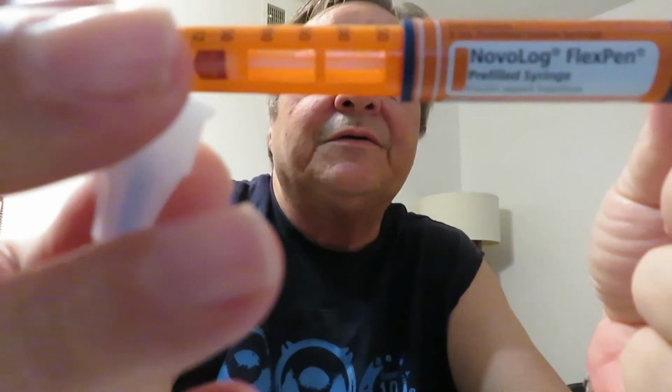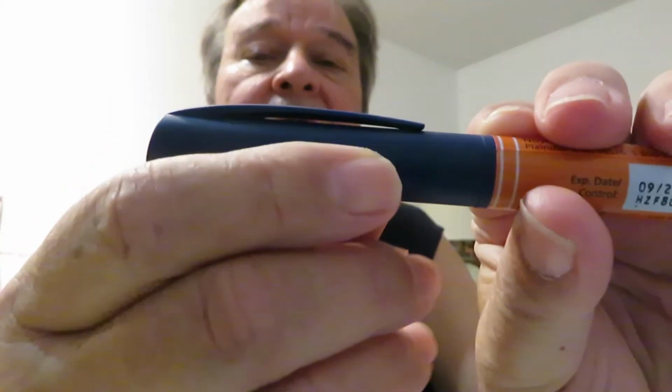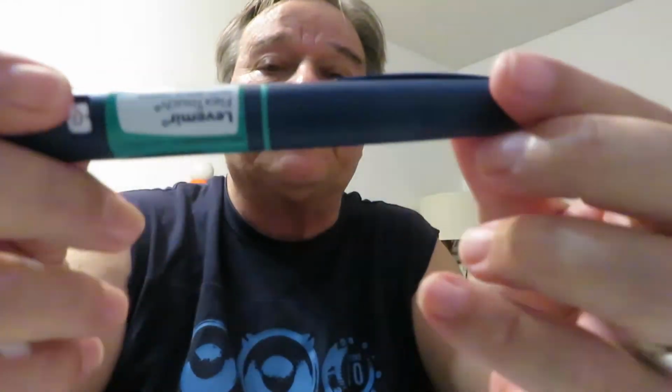And with these pins, this is the Novolog with the needles. They're really convenient because when you go somewhere, you just put the needle on there. I was going to tell you that. Take that off. Put the cover on. See, it's got a pin clip there for your pocket. This one's also got a pin clip for your pocket.